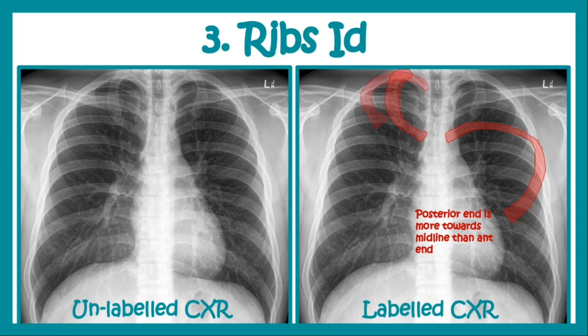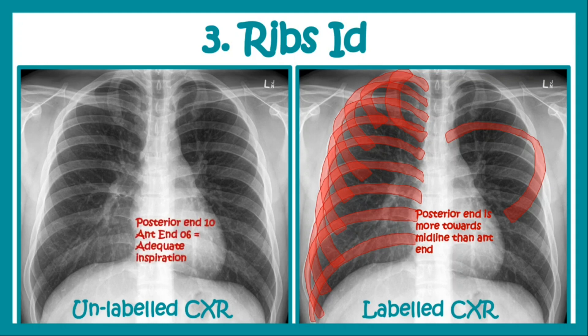By this fashion we can identify all the ribs one by one: first, second, third, fourth, fifth, sixth, seventh, eighth, ninth, and tenth rib. In a proper end-inspiration chest x-ray you will see 10 posterior ends and 6 anterior ends. If there are 10 posterior ends and 6 anterior ends, that indicates adequate inspiration. It is your job to identify the ribs on the left hand diagram — both the anterior end and the posterior end.